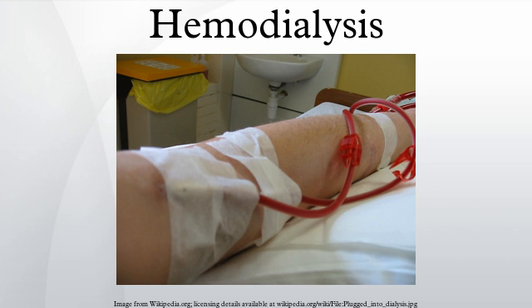Although automated reuse is more effective than manual reuse, newer technology has sparked even more advancement in the process of reuse. When reused over 15 times with current methodology, the dialyzer can lose B2M, middle molecule clearance and fiber pore structure integrity, which has the potential to reduce the effectiveness of the patient's dialysis session. Currently, as of 2010, newer, more advanced reprocessing technology has proven the ability to completely eliminate the manual pre-cleaning process altogether and has also proven the potential to regenerate, fully restore, all functions of a dialyzer to levels that are approximately equivalent to single use for more than 40 cycles.